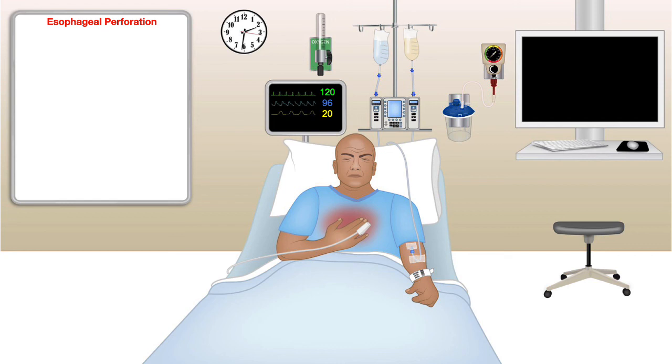So next, let's talk about esophageal perforation. Typically, when a perforation happens, experienced endoscopists can usually recognize it during endoscopy. Sometimes if it is not recognized, when the patient comes into the recovery area, they may have chest pain, may be short of breath, and their vitals may be off the chart. They may even have fever.